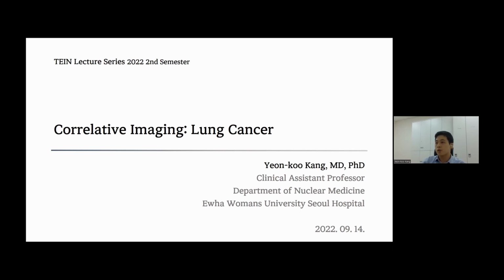More specifically, we will summarize the basic knowledge such as normal anatomy and structure of the thorax and TNM staging, focusing on the evaluation of lung cancer based on CT and FDG PET-CT. Today's topic is not about something new, but a set of basic and core things that nuclear medicine physicians must know. I believe you already know most of what we are going to cover today, but I hope this session will be helpful to you by revisiting and summarizing them.